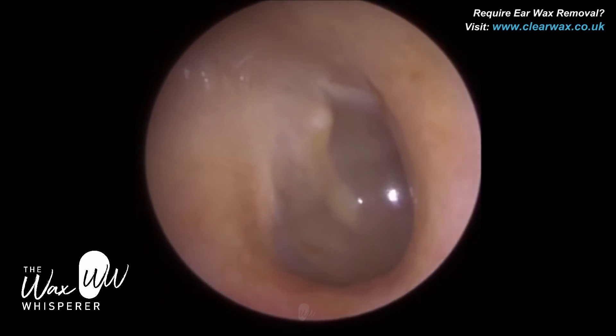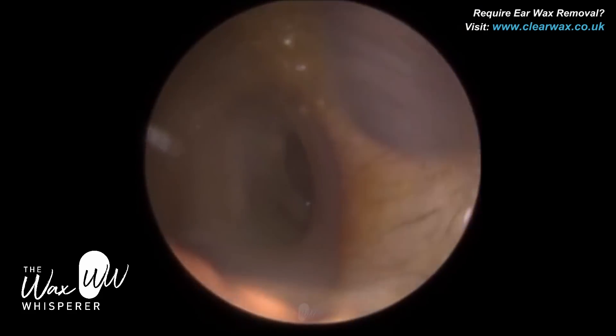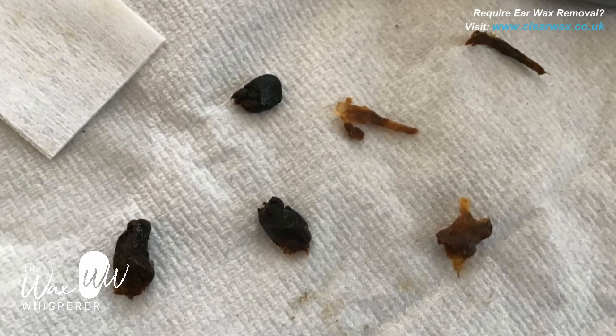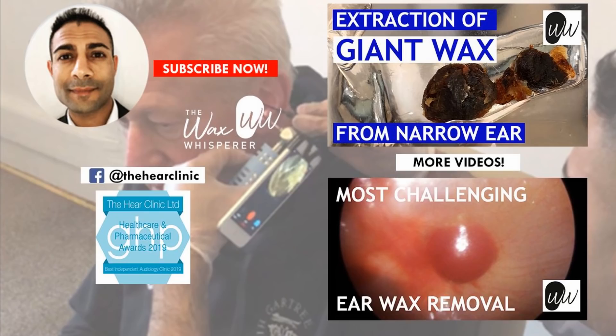That's a very healthy eardrum — we call it the tympanic membrane. And in a moment you'll see some still images. That's the wax — see how dark it is, it's really black, really oxidised. I gave her a very polite tap on the wrist — she should know better, being an audiologist! I'm sure I'll see her much sooner in the future. I've just weighed it at 667 milligrams — quite a big haul.